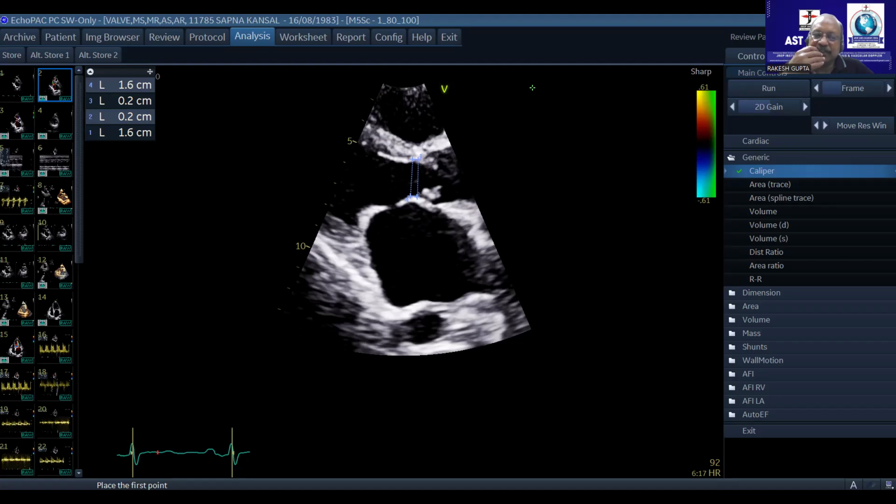Okay, go ahead. So A1V1 equals A2V2, so if we put the values in, we get it. So what she means to say is whatever blood is flowing through the LVOT has to flow through the aortic valve. In the aortic valve, we have to calculate this area. Here we have an area and here we have a VTI. So if I take this area into VTI and divide by this VTI, I'll get the aortic valve area. Is that correct? Yes, sir.